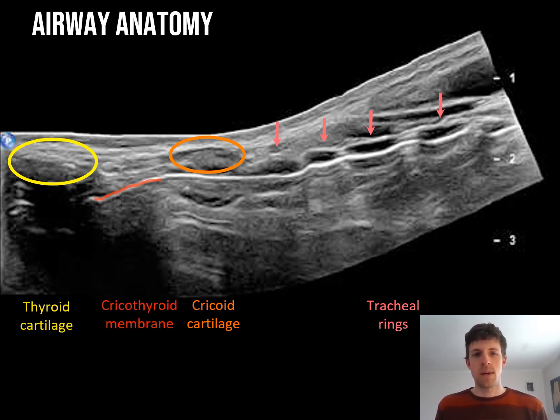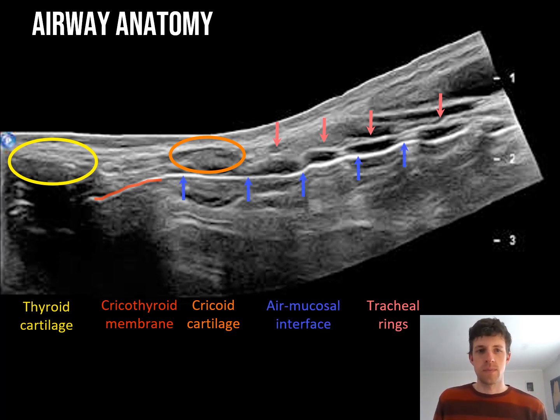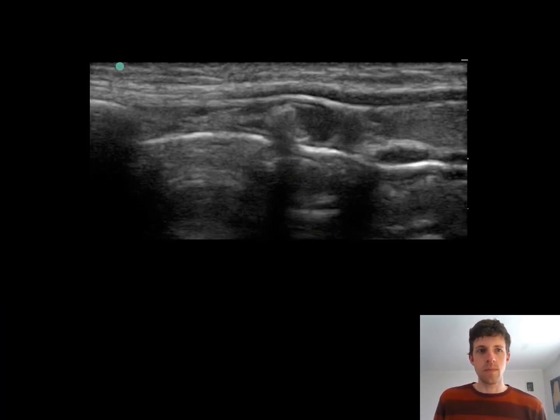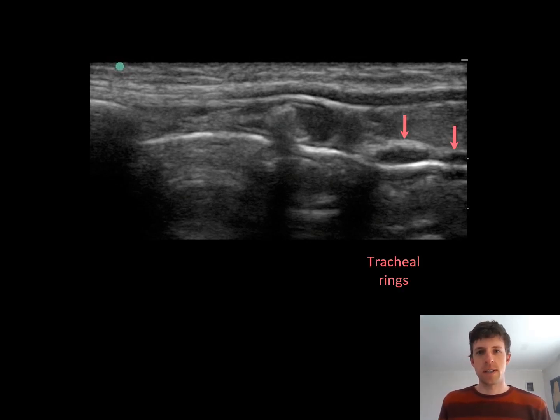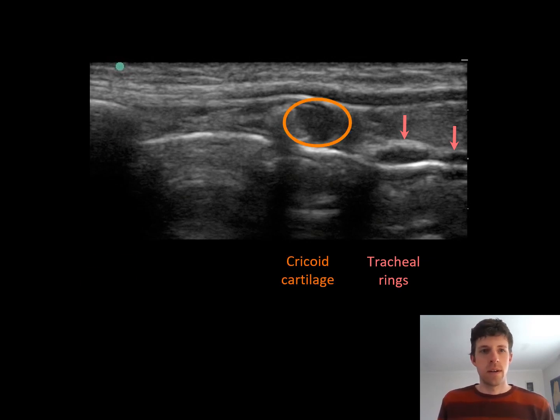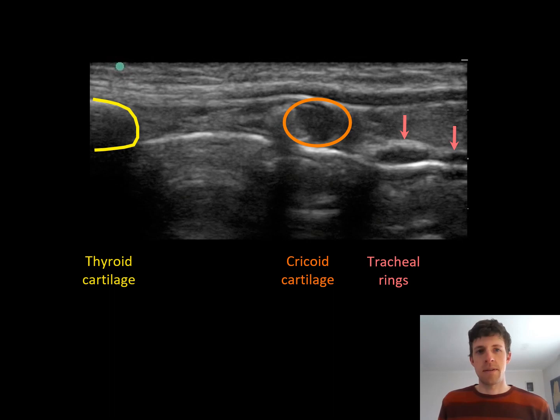The bright white appearance is generated by the air-mucosal interface within the trachea. Here's another annotated version of the ideal image you are after. You can see the tracheal rings at the right of your screen with the cricoid cartilage, the thyroid cartilage, and your target, the cricothyroid membrane, sitting right between the two.